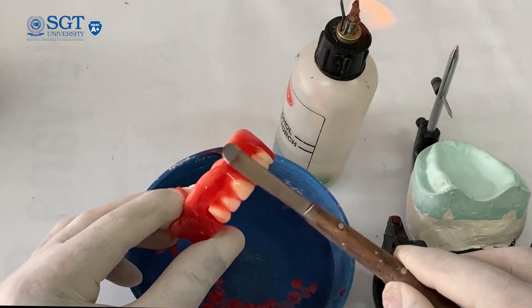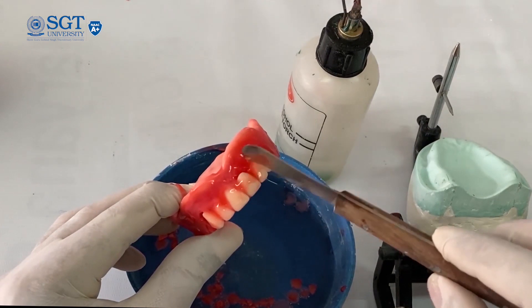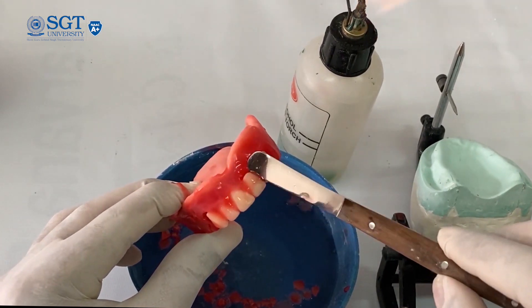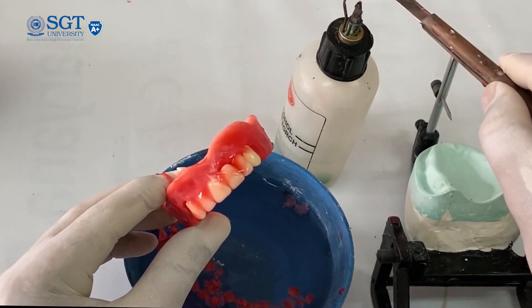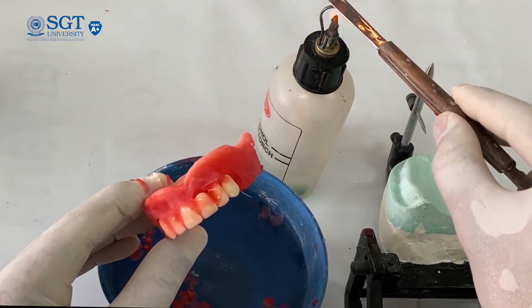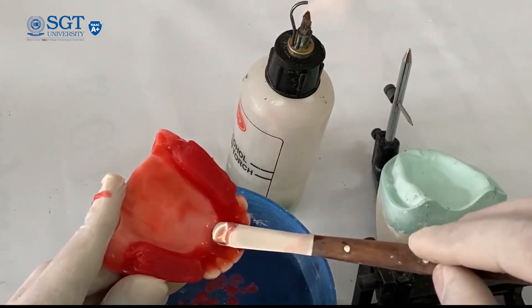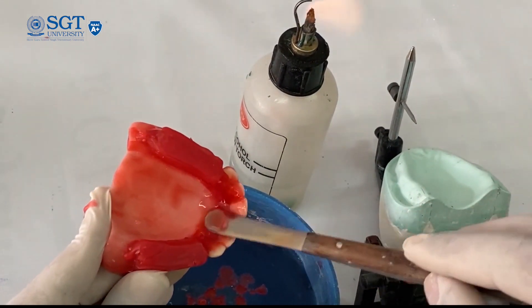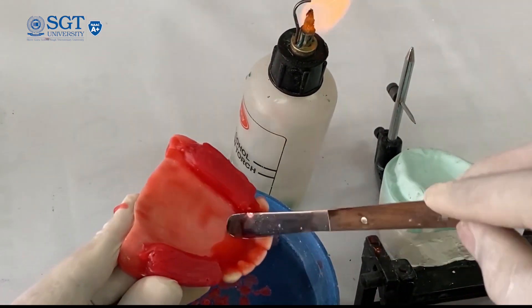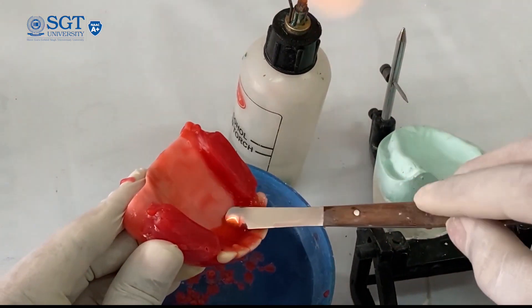To maintain the set teeth in position, the wax supporting the teeth should be heated and sealed both to the teeth and to the denture base. This is very important to maintain the position of the set maxillary and mandibular anterior teeth.